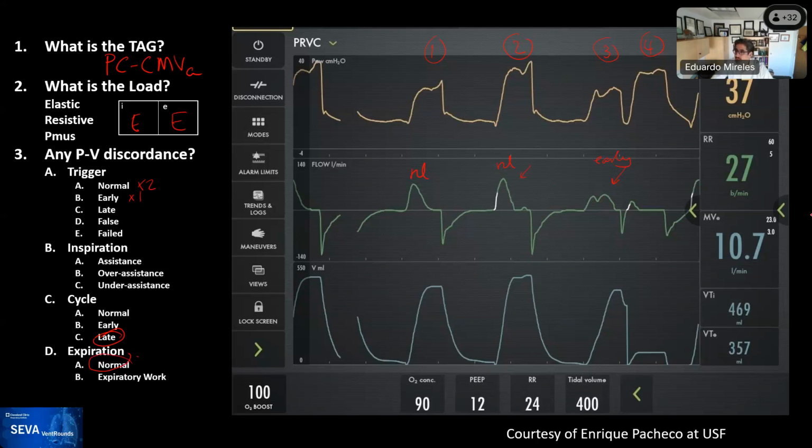The rise angle seems to be the same. So it seems that the P rise time is not set as its maximum. Yes, now I understand what you're saying. So Ariel is commenting that the speed with which the pressure is rising is not very fast. Sometimes this is a button that gets touched a lot, which is the pressure rise time, and so it gets moved down so that there's not this little blip, which means nothing. And so, yeah, you're right, Ariel. It seems that it's delayed on the way that it goes through.